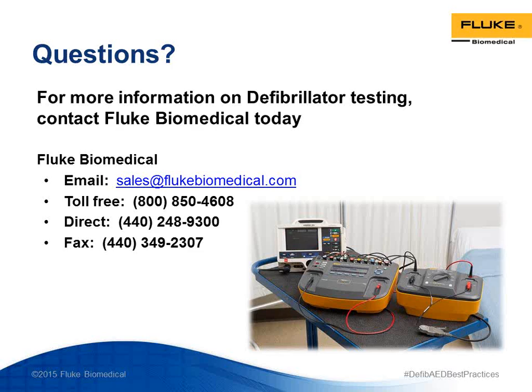The other way to look at this, because I really want you to think about this and not just follow because everybody else is doing something: our job as biomedical engineers is to reduce the risk to the patient from the use of the medical device upon them. And we see that with 72,000 incidents just about AEDs, just in the United States, that we absolutely are not inspecting either frequently enough or not looking at the right things in order to knock the number of events and incidents down.